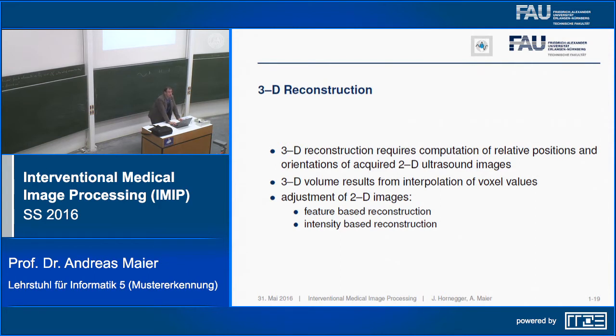If you have very experienced users, they might be able to get very well the same slices that you need for measuring certain orientations or for measuring certain lengths. So in particular, the length of specific bones in children or in fetuses are interesting for the development of the child, and they use that as predictors in order to determine whether the development of your child inside the mother's body is really on track or if there's something delayed.